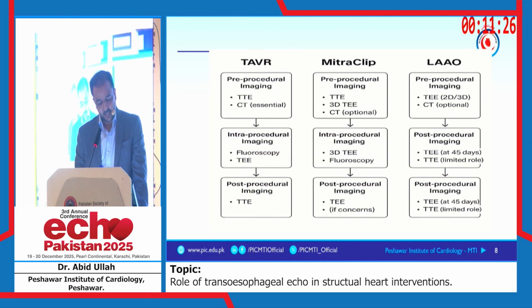The TAVI, as I said, is CT based, and we have a talk on the CT assessment for the TAVI. The mitral clip and left atrial appendage are the domain of echocardiography, and CT has a very limited role to play there.